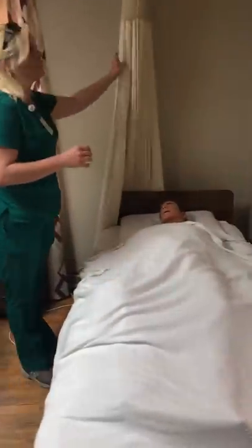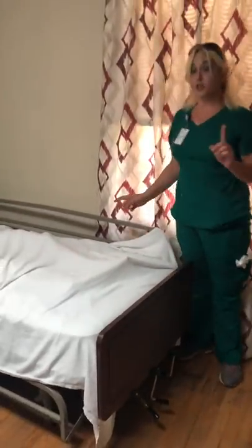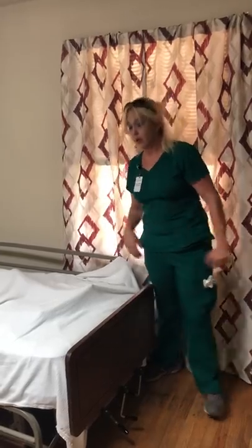I've collected my supplies and I'm going to provide privacy. I'm going to come over here and put this side rail up. You have the option to either put the side rail up or ask the RN observer to come stand on the opposite side of the bed where you're working. Make sure you're aware of that so you can utilize it if necessary.